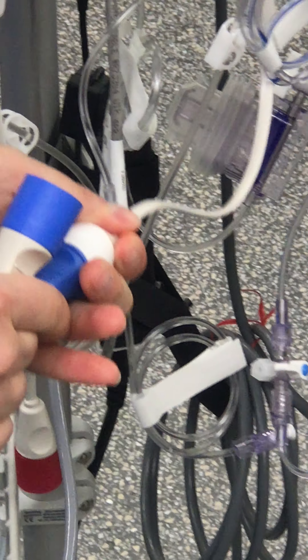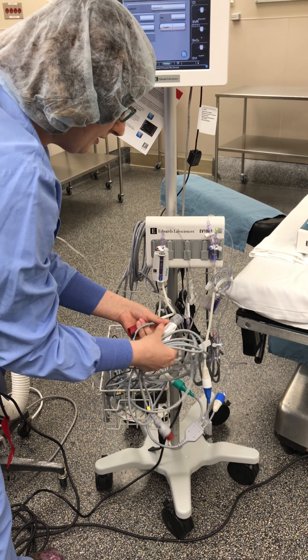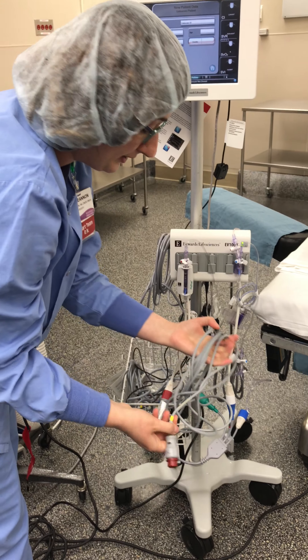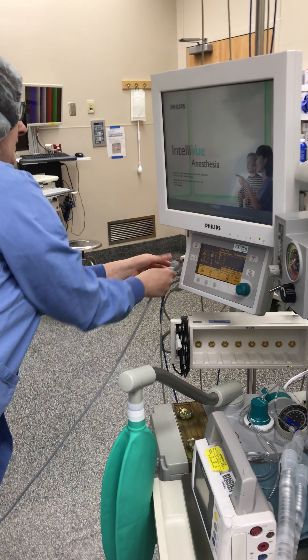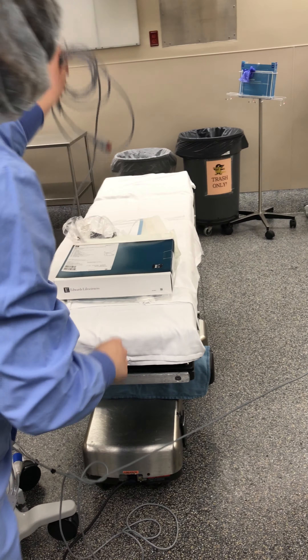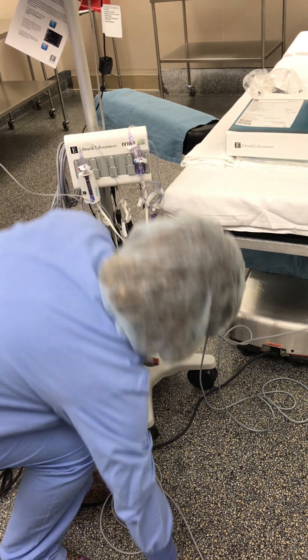Your blue one here is going to go to your CVP, and that's hooked up. Now the red one here is going to get a regular arterial line cable. We're going to hook that up, and then we're going to hook up the other end to our anesthesia monitor. And then we're going to do the same thing with our CVP line — this gets hooked up there, and then this gets hooked up to our anesthesia monitor.